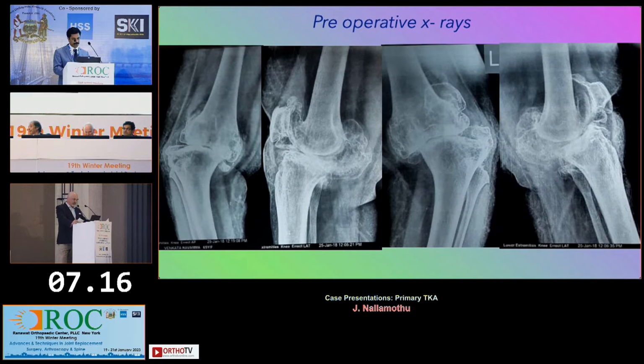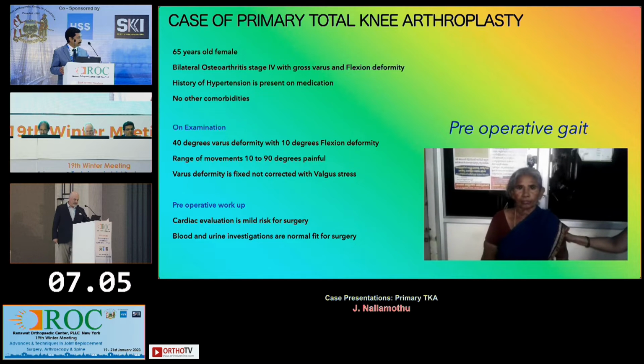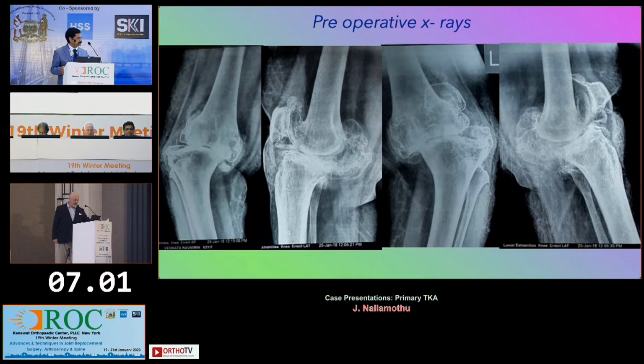All right, so Suri, do you see any challenges here? How would you tackle this? Can I have the X-rays? I think a lot of this is the medial condylar osteophytic overgrowth with subluxation. More often, when there is subluxation, the moment you take out the osteophytes, you are able to correct it much more easily.